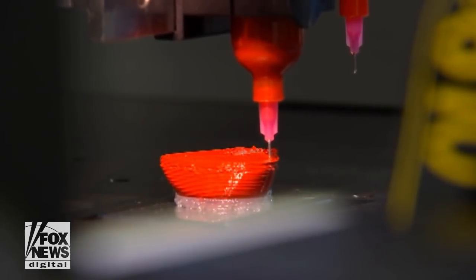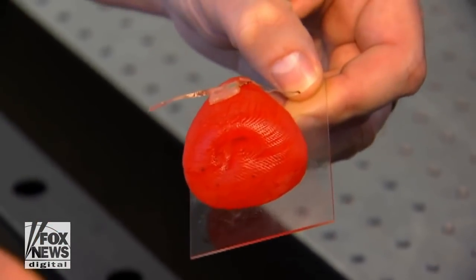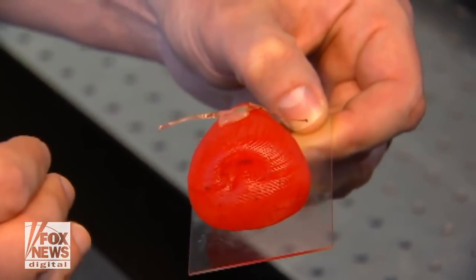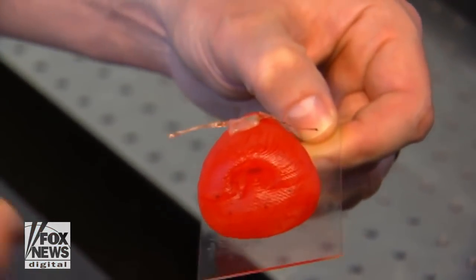These 3D models are smart too, equipped with electronic sensors which are also 3D printed. This actually gives electronic feedback based on how hard the pressure of the surgical tool is applied.